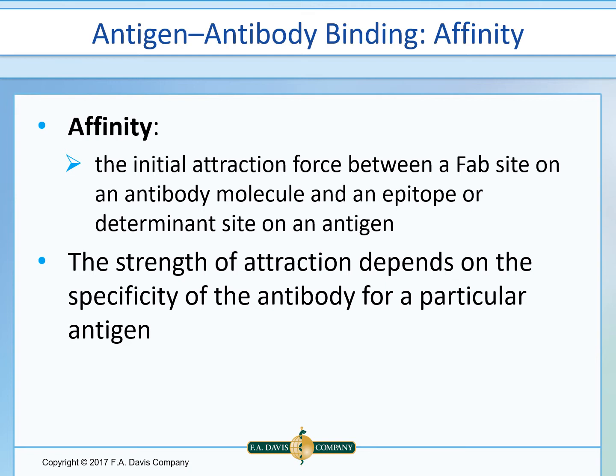Antigen-antibody binding plays an important role in the laboratory in diagnosing various diseases. Immunoassays have been developed to either detect antigen or antibody, and they vary from easy manual tests to more complex automated assays. The first of these assays were based on principles of precipitation or agglutination.